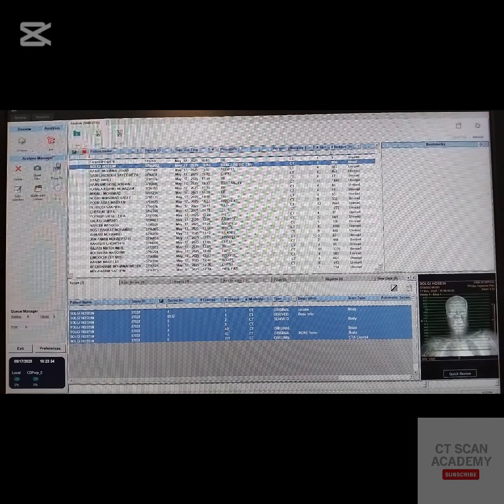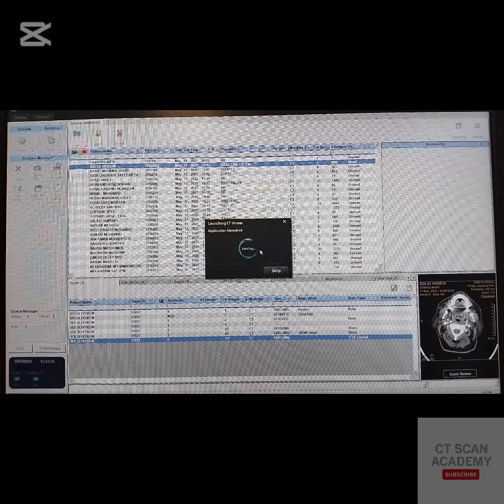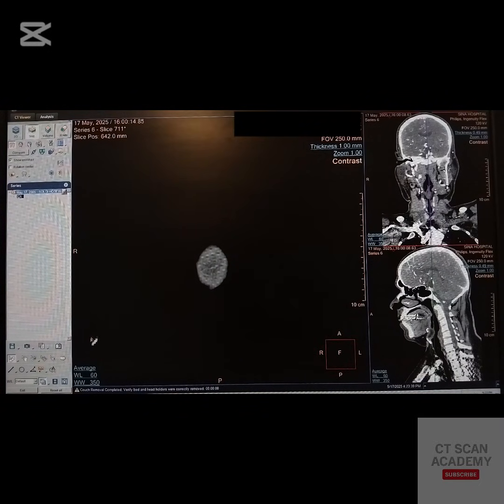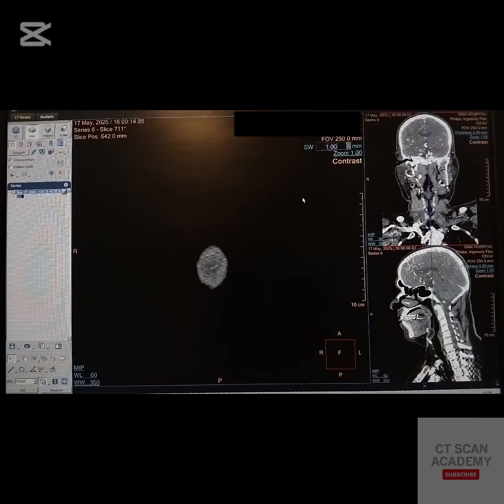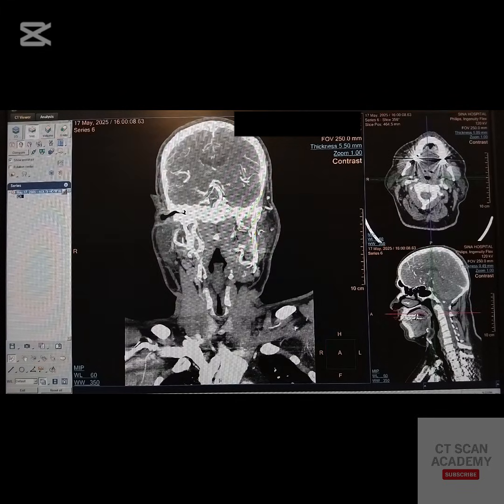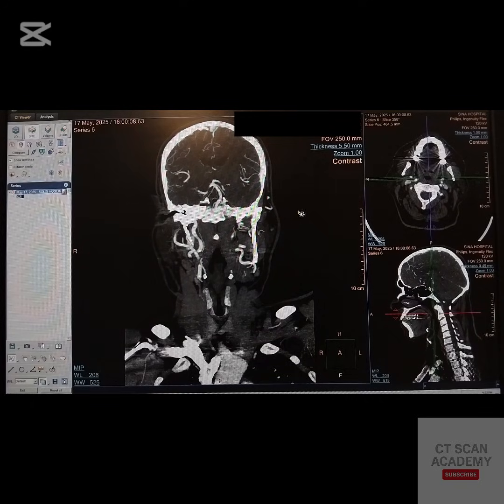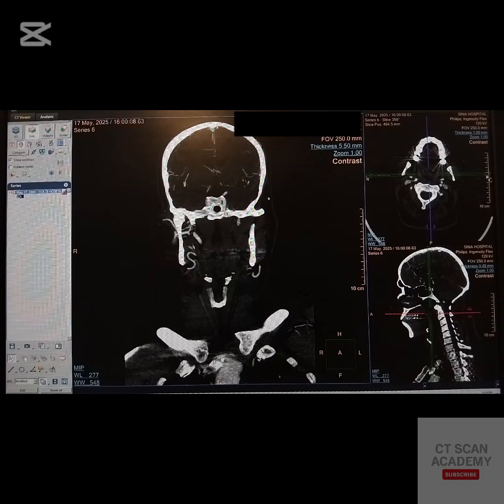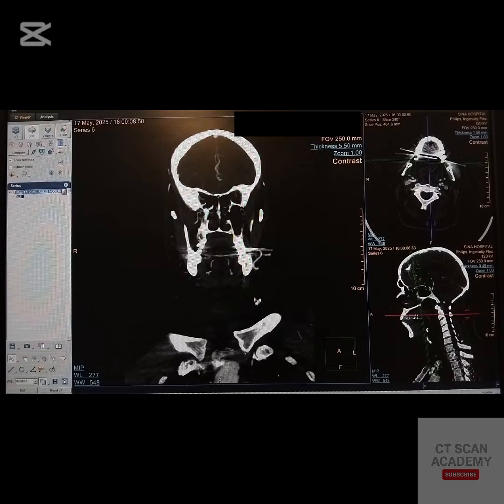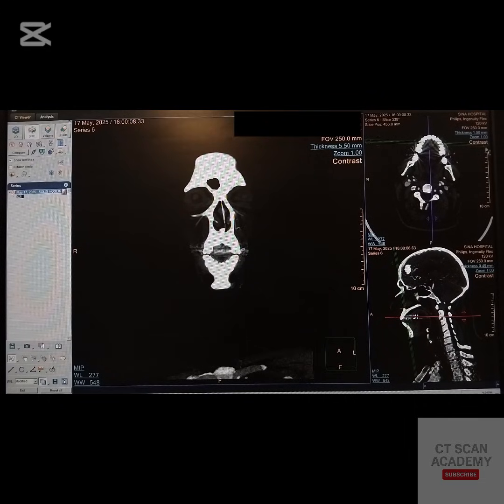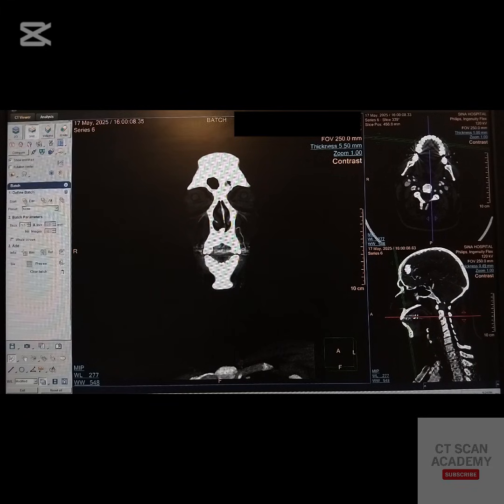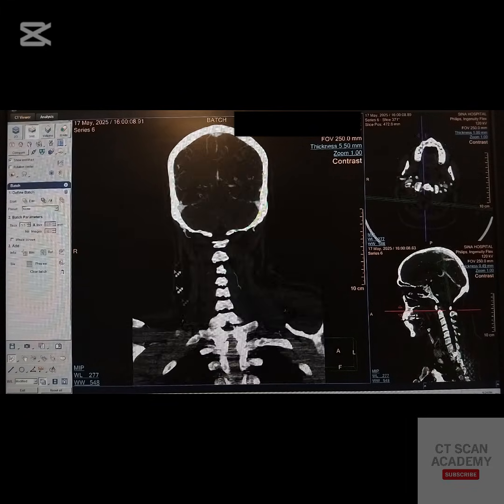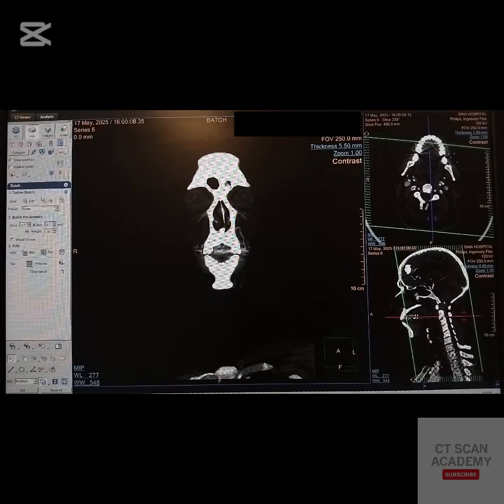Next is the post-processing stage. Start by creating MIP images, then perform MPR reconstructions in sagittal and coronal planes. Adjust the window width and window level for optimal vascular contrast. Reference recommends an increment less than 2.5 mm.